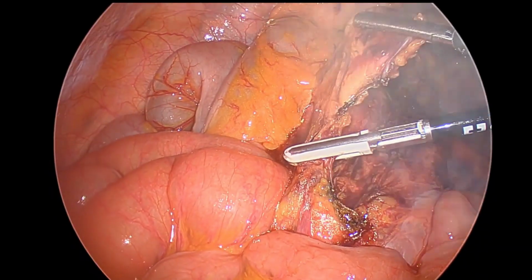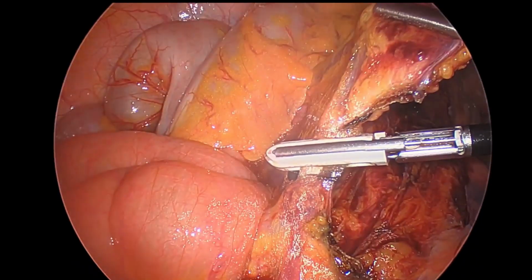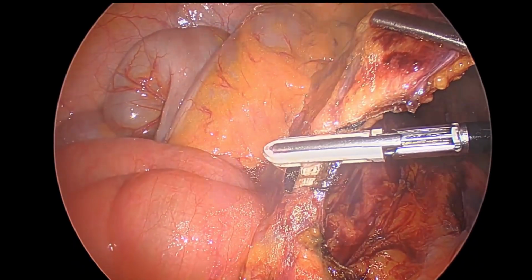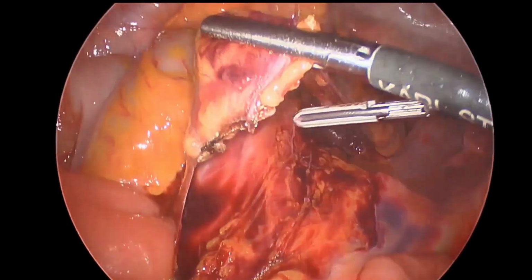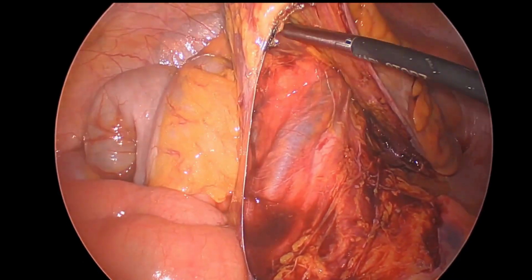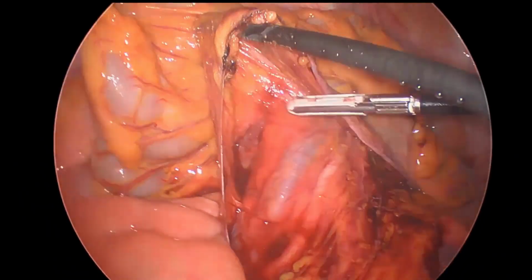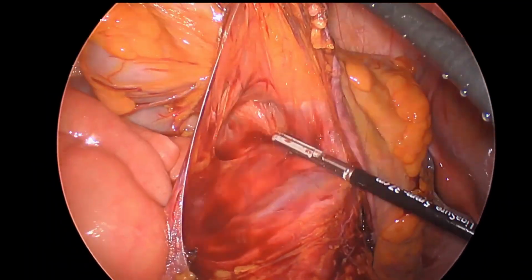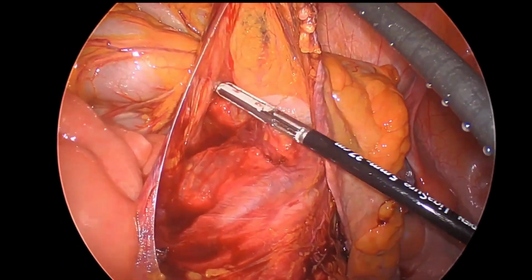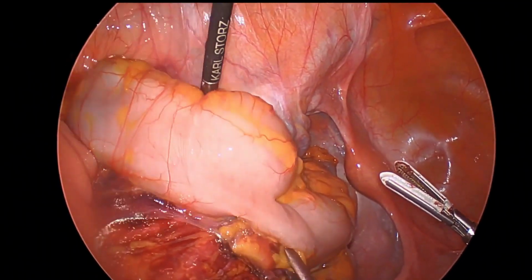So here we are taking the vessel with the ligature device. You can take it with clips, you can take it with a stapler. We tend to take it with an energy device. Here is the ligature. Again, we don't have any disclosures with respect to the company. It's just what we happen to use. You can use any vessel sealing device that you choose. And we're going to again try to exploit that retroperitoneal dissection, make sure that we have enough length.